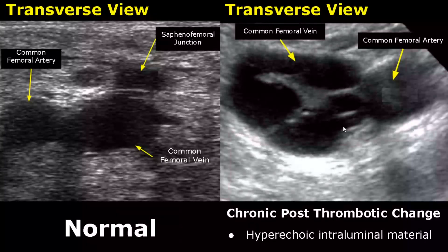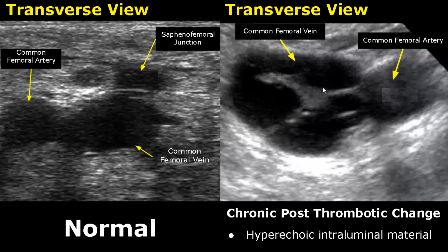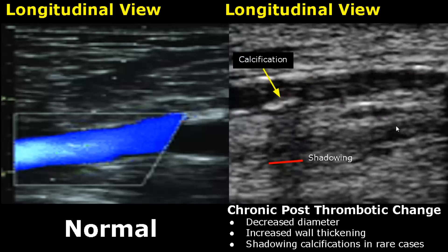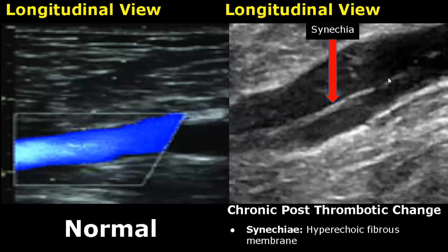Chronic post-thrombotic changes have their own features. These are chronic cases of deep vein thrombosis. The intraluminal material becomes hyperechoic. The vein may have a decreased diameter and undergo an increase in wall thickness. The wall of the vein may also be irregular. In rare cases, calcifications with posterior acoustic shadowing may be found attached to the vessel wall. You can also see a decreased diameter of the vein. Synechiae is a hyperechoic fibrous membrane that may be found in chronic post-thrombotic change.